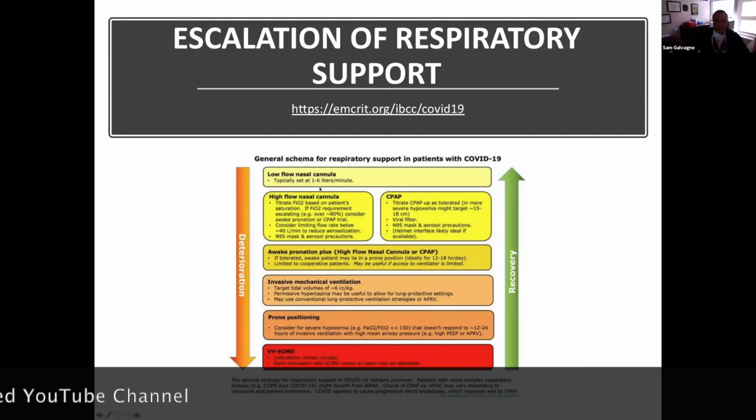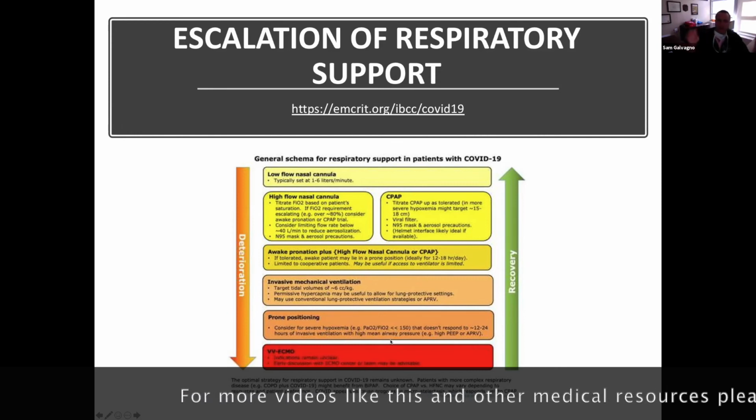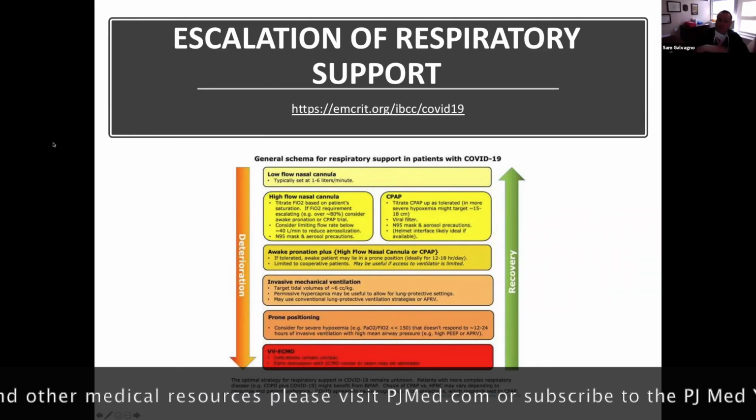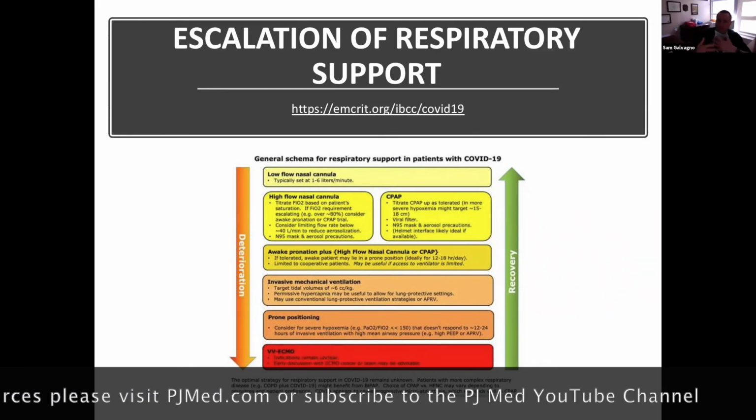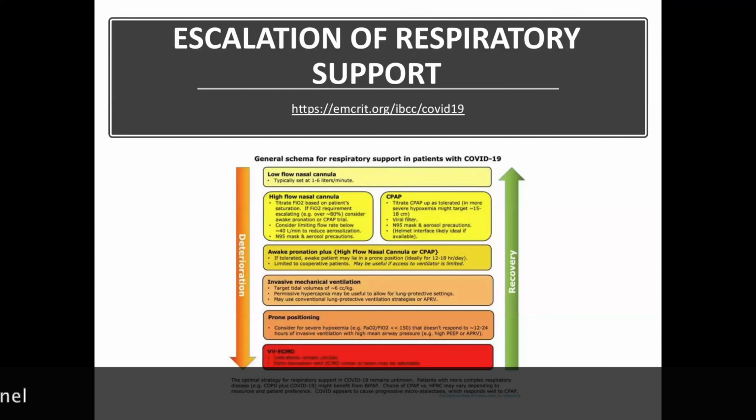So they talk about 1 to 6 liters, just like we had in that first case. So you escalate that. You can go to high flow nasal cannula, which we've talked about, can deliver really high flow rates. So you guys know what a nasal cannula is. You know you can give 6 liters a minute. That's kind of your maximum, right? Is that your maximum by protocols? Do you go to 8? 4 to 6? 6. Okay, gotcha. So 6.